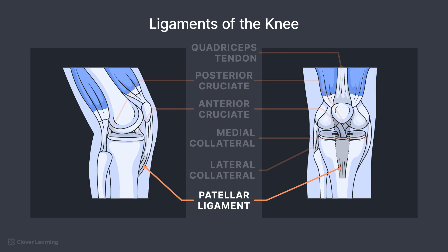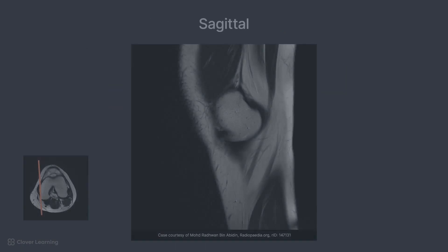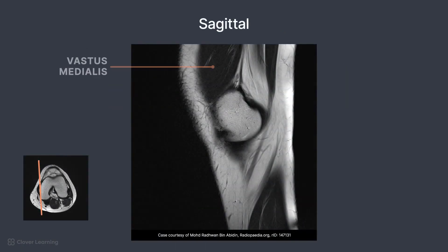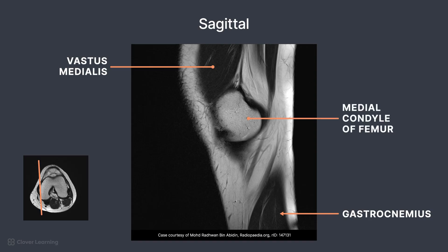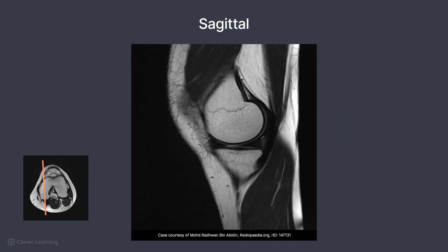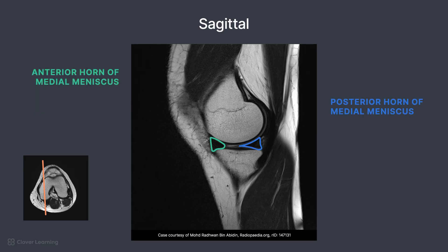Let's take a look at the anatomy on some MRI images, starting with the sagittal plane. Starting from a medial position, the vastus medialis muscle is seen on the anterior portion of the upper leg. On the lower leg, we can see the gastrocnemius muscle. The medial condyle of the femur is demonstrated. As the slices move laterally, the anterior and posterior horn of the medial meniscus is well demonstrated.